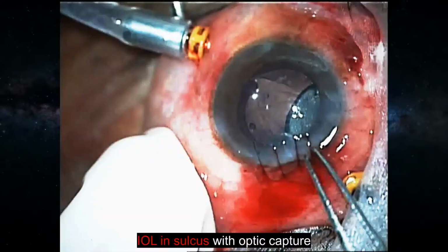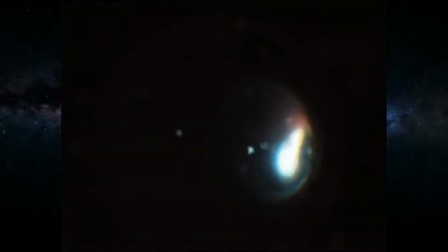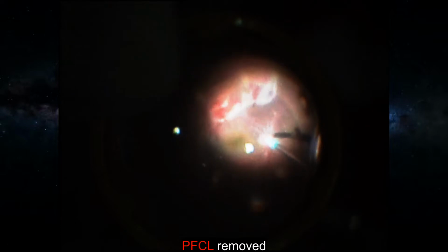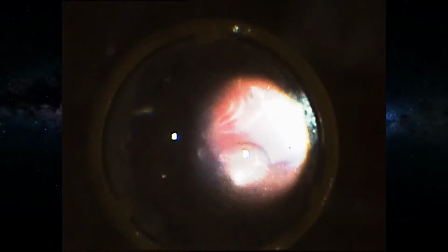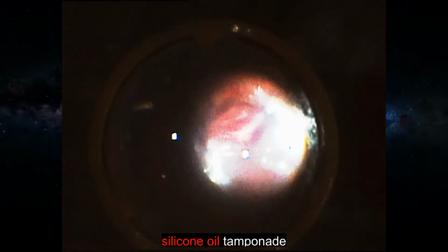An IOL was placed in the sulcus and optic capture was done. Cryo was applied to the site of wound entry. PFCL was removed and air fluid exchange performed. The case was concluded with silicone oil tamponade.